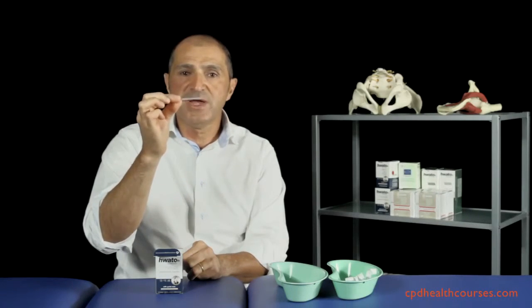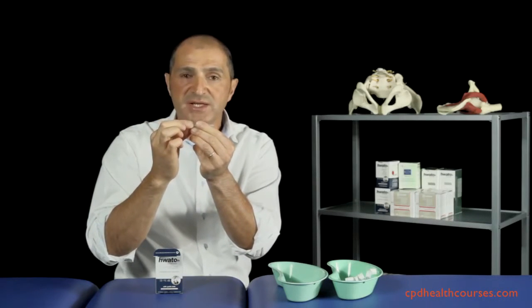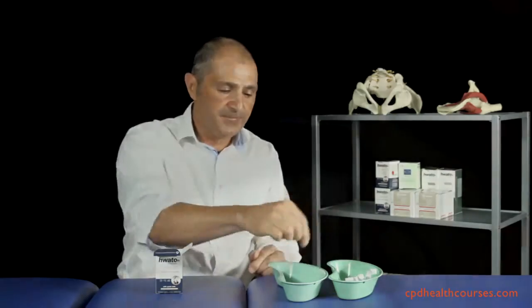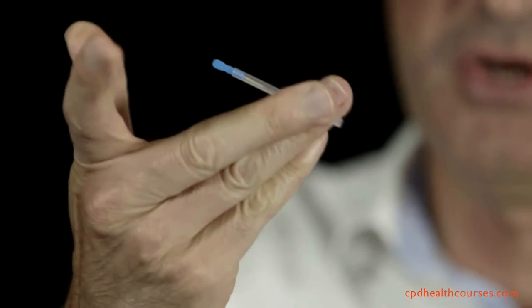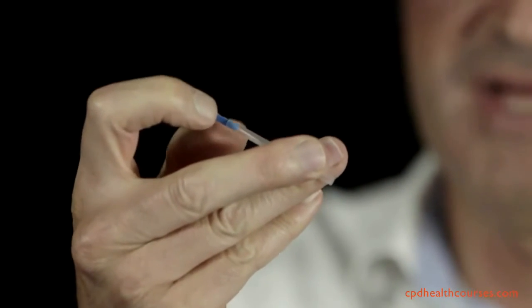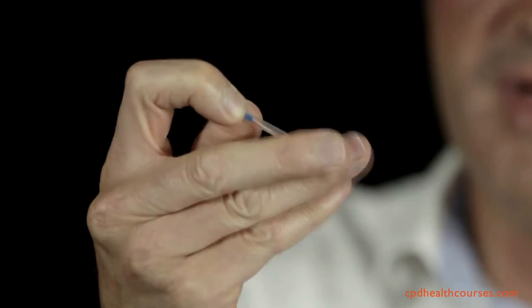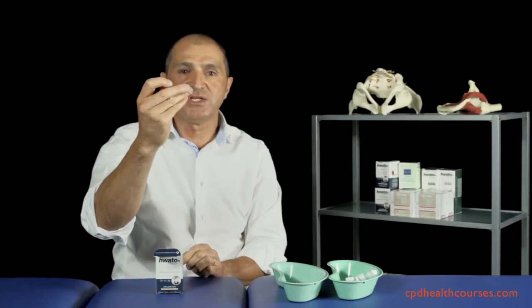The second method is a little more tricky, but it's worth having a go and practicing that because it looks so much better. Well, let's show you what that looks like. Pop your fingers like this on the bottom of the guide tube so that I can retain the guide tube as I then pull the tab out of the top and retain the needle against the guide tube. So what I do is I hold it down and pull the tab out, pop it into the waste kidney dish, and then I'm ready to go.